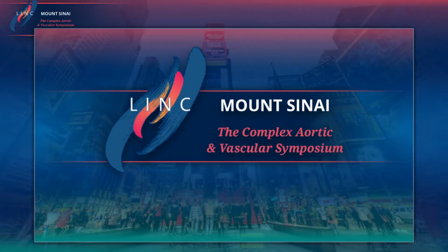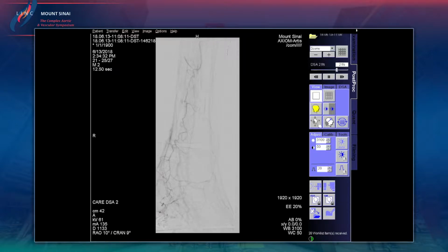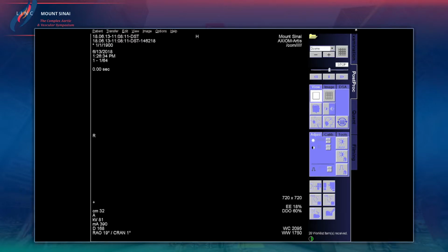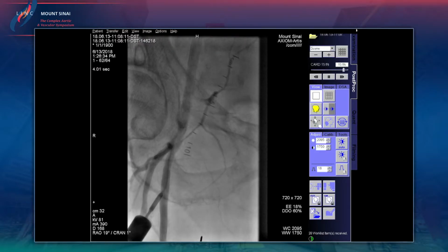Well, thank you very much for this update. And I'm hearing the cath lab is ready, so we can go back to Prakash. Hi, Dirk. How are you? Great lectures. We had a lot of pleasure here listening in while we were trying to get this case ready. So without further ado, we're going to go ahead and present it. You guys know the team.